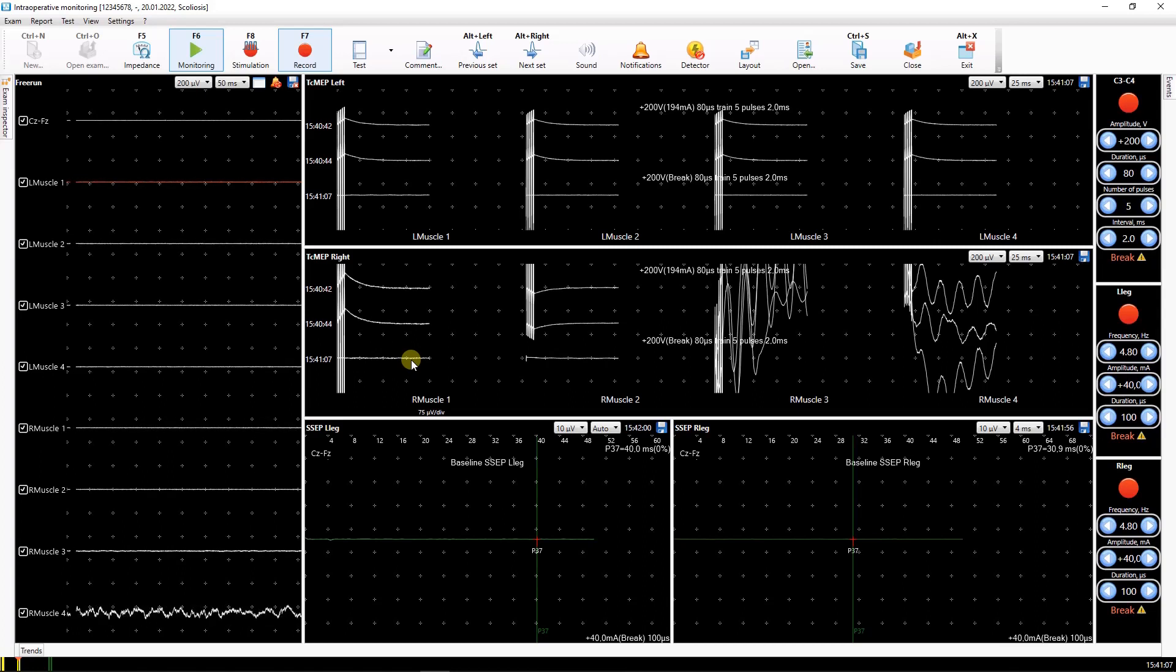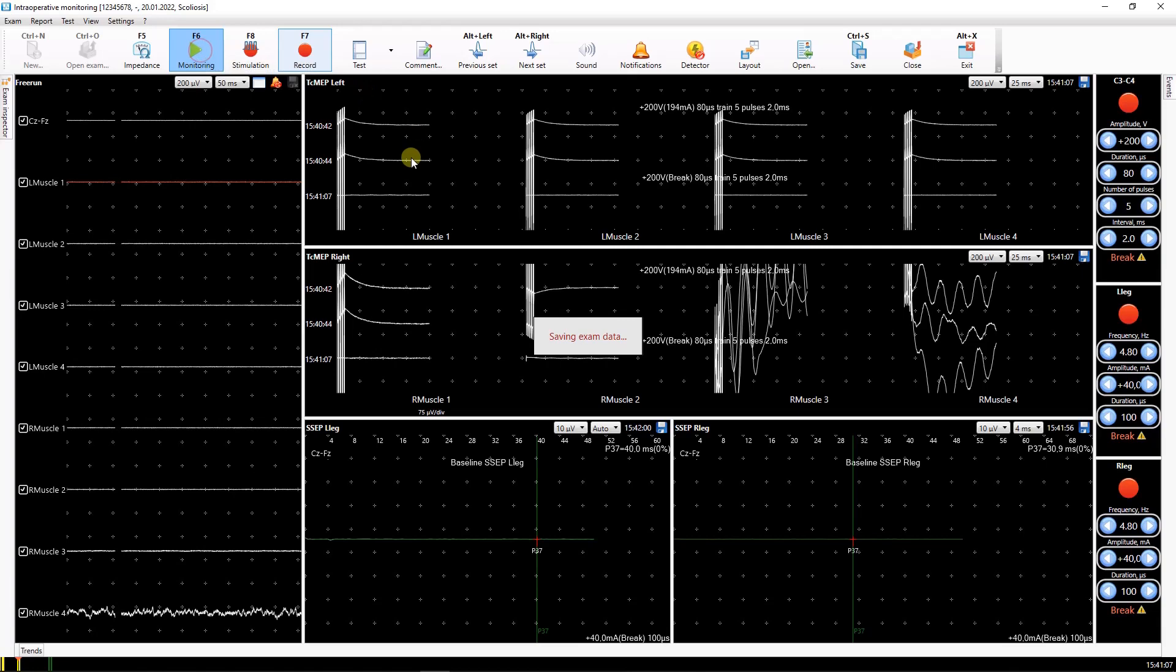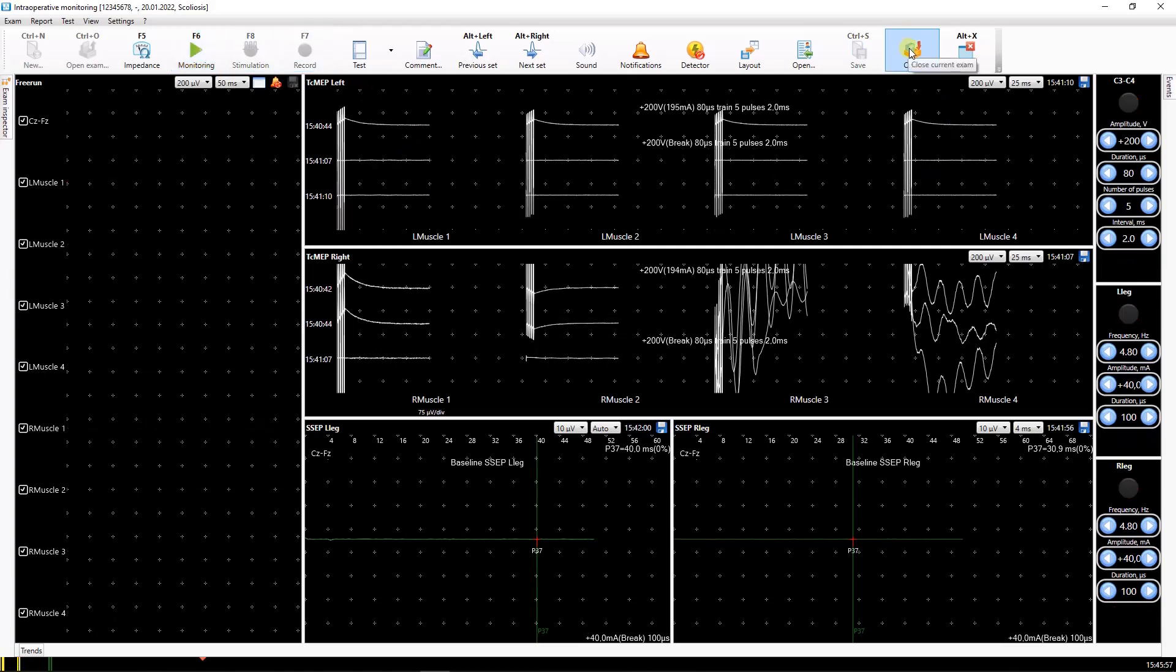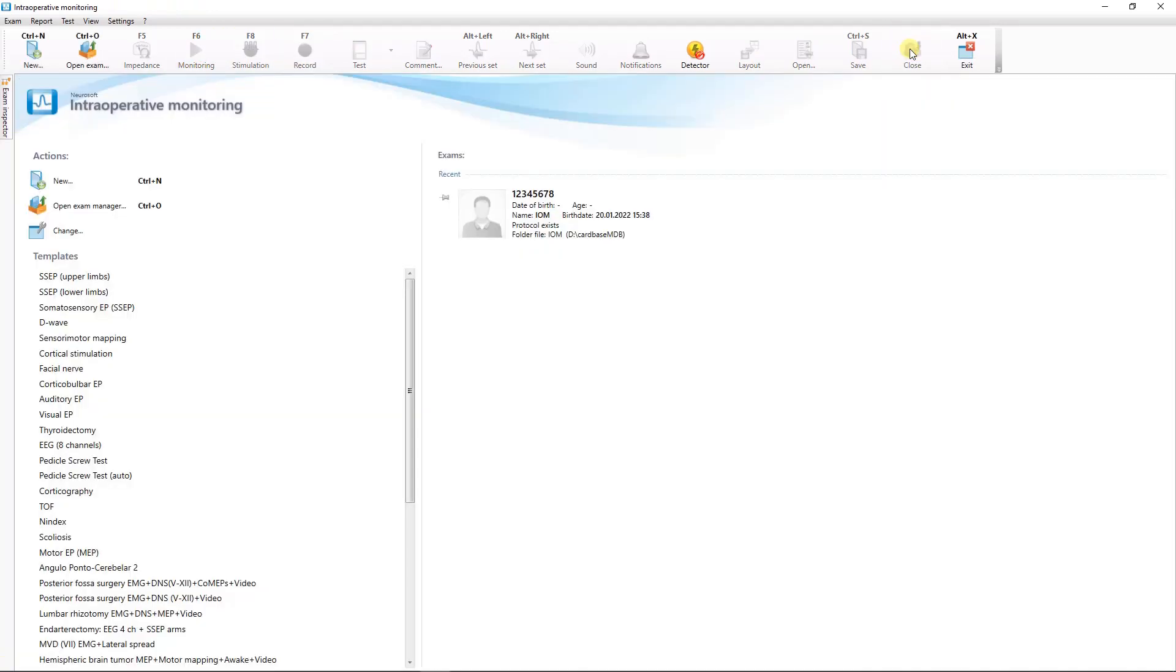To finish monitoring and close the test window, use the close button on the toolbar. After that, the saved exam can be opened to review or continue monitoring.